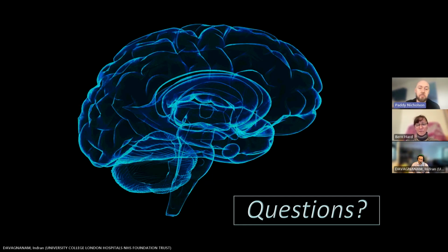And in terms of imaging them in more detail, the imaging we have is pretty much as good as we're going to get. We saw some beautiful high resolution CT. We also see photon counting CT, but it's only in a very small number of centers and not widely commercially available yet. We saw some high resolution 3 Tesla MRI. I think that's all the imaging you need. I don't think we're getting down to the millimetric level in these. So I don't foresee any fancy imaging techniques that will really change the game in imaging these. But as I said, I don't necessarily think that we need to.